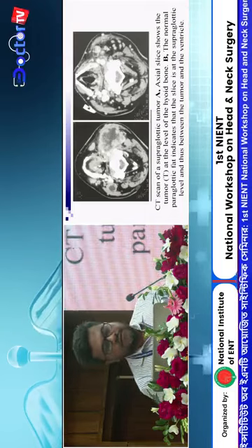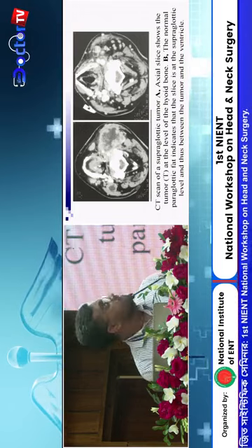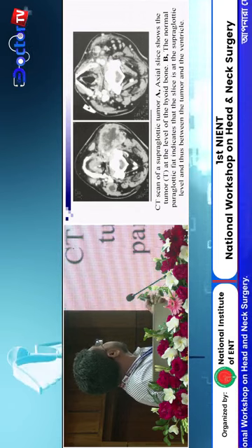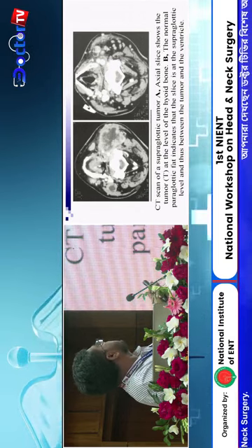And disproportion of tumor and lymph node, a small supraglottic mass at the thyroid level, hyoid bone level, and we see there are large necrotic lymph nodes of different sizes in both sides.